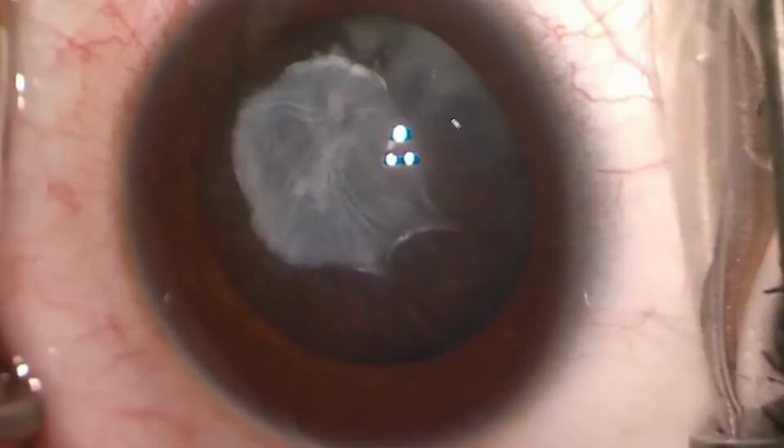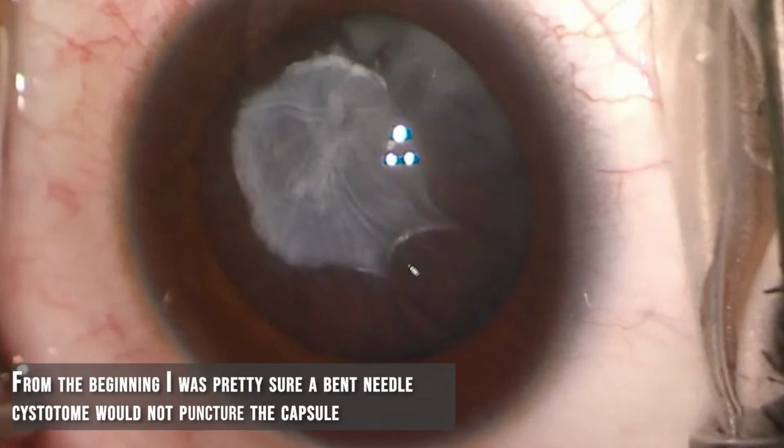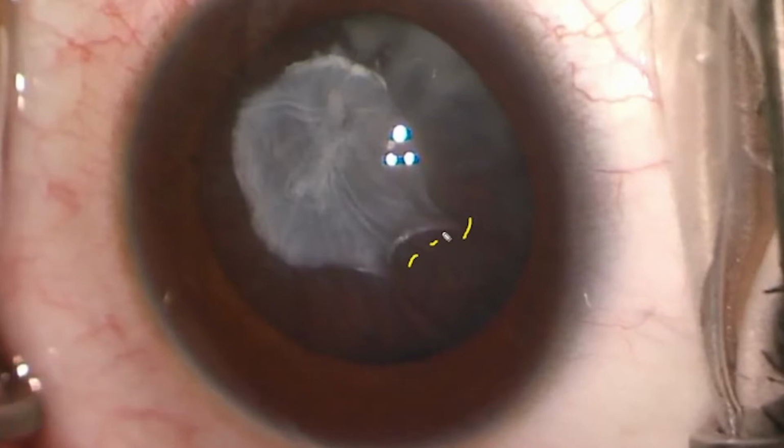Now let's summarize where we're going to attempt to place the capsulotomies. We're going to try most of them with this side port blade. The first will be through capsule only right here. The second will be adjacent to it. The third will be with the scissors right here. The fourth and the fifth will be along the capsular plaque, non-plaque junction. The sixth will be here, and the seventh will be here. The one that will finally work will be over here, and we'll make that a special case.